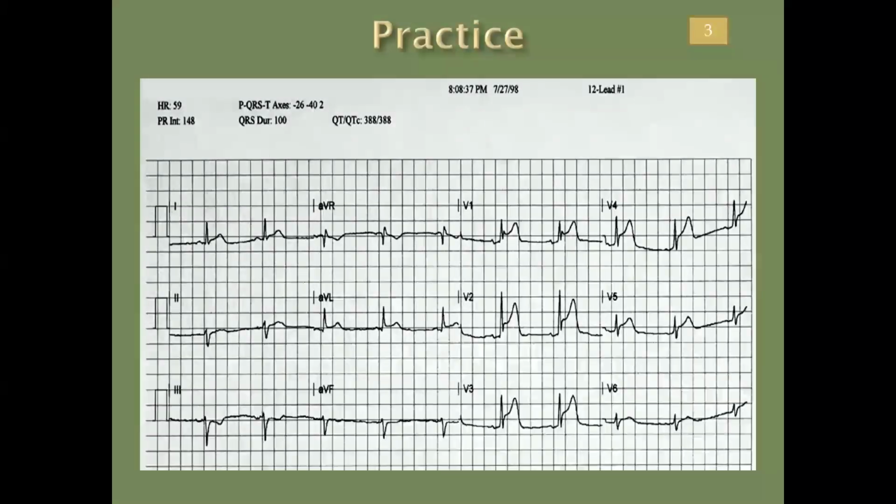Again, look over here. You can see we could draw eyes and put that not smiley, frowny face up here. This is another one where the little pictures just show you what part of the heart and the vessel is involved here. So this patient is having an acute anterior septal MI.